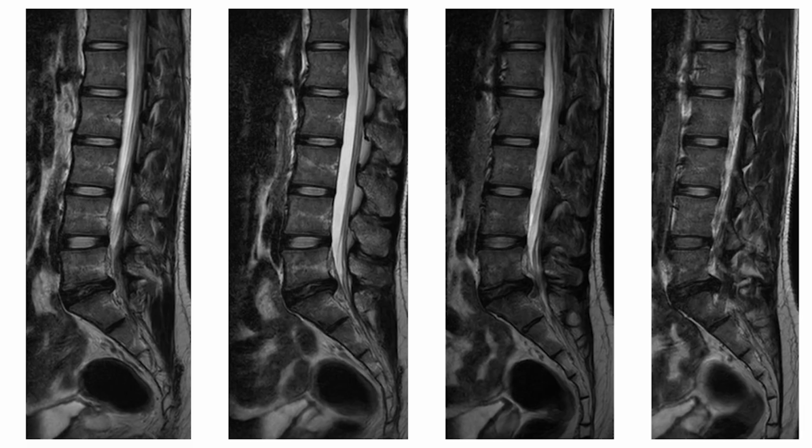So this is the case of L5-S1 paracentral disc prolapse in a very young patient, a 26-year-old male who was having symptoms since the last 1 year. Every sort of conservative management was tried. The patient came back after 1 year with severe symptoms, and here the disc prolapse had progressed compared to the last MRI.